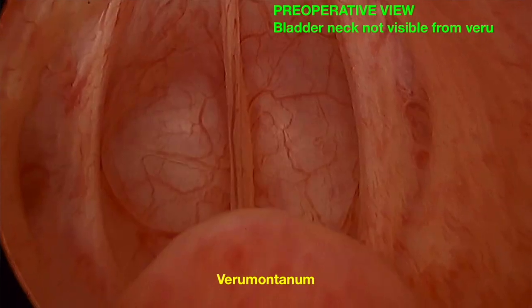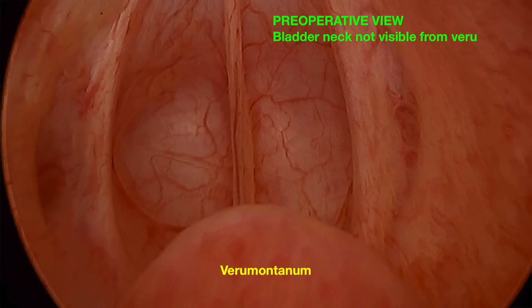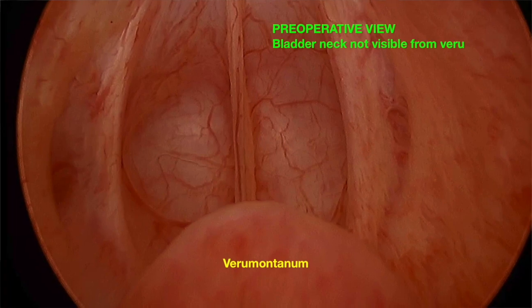And above you can see that from our endoscope at the level of the verumontanum, you can't really see the bladder. So this, we are at the bladder neck. Ordinarily, it should have been possible to see a wide open bladder neck. We don't see it here because there is an obstruction at the bladder neck. This kind of an appearance of an elevated bladder neck with an obstruction is suggestive but not entirely conclusive in making a diagnosis, which is why you need help from the video-urodynamics to make this diagnosis.